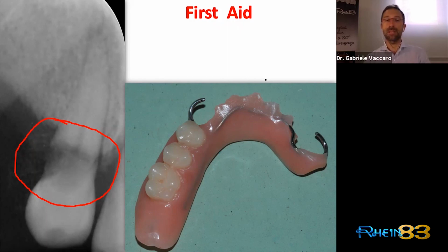But I don't practice this kind of procedure anymore, because I found a new problem doing it this way: I'm putting a new clamp that generates horizontal force on the canine, and the problem that I had on this tooth after a few years, I'm going to find it on the canine.